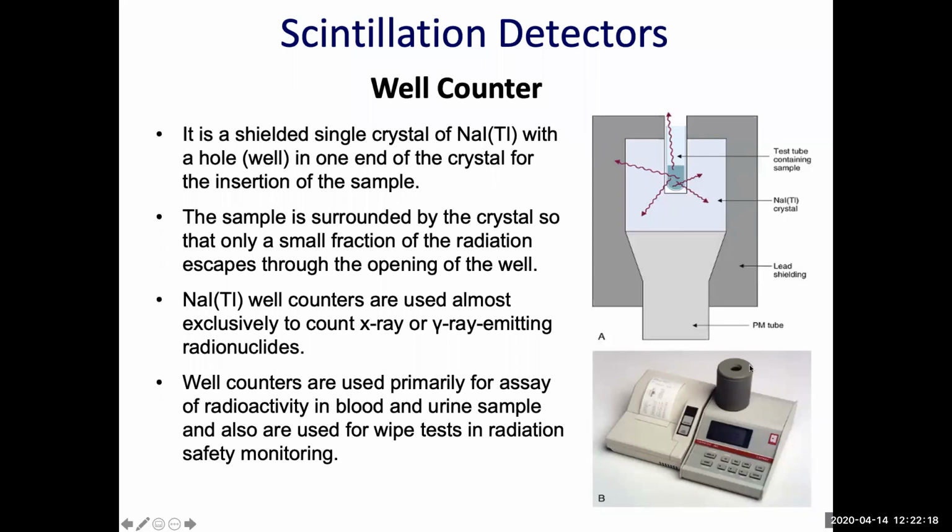The sample is surrounded by the crystal so that only a small fraction of the radiation escapes through the opening of the well. So that's why it has high efficiency, because most of the photons emitted by the sample will be detected by the detector surrounding the sample.